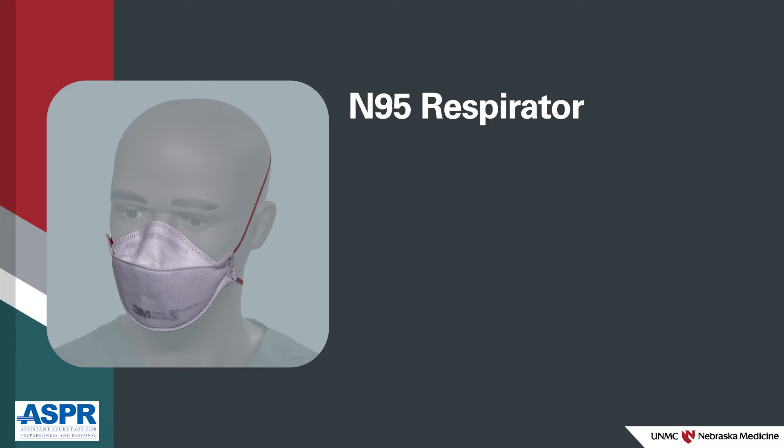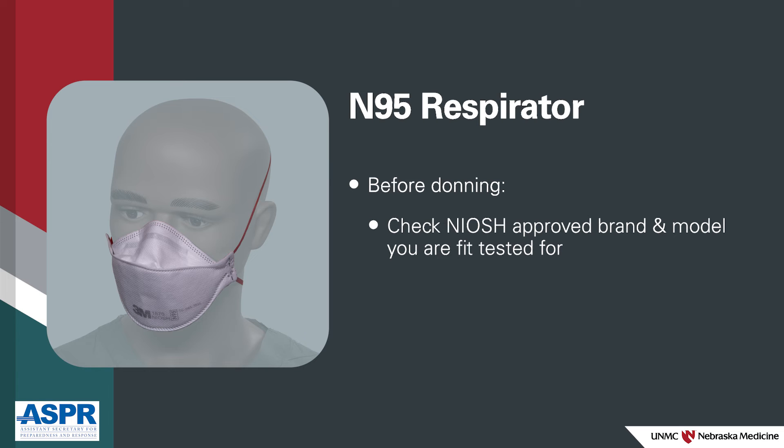The N95 respirator goes on next. Before putting on an N95, you should ensure it's the NIOSH-approved brand and model you have been fit tested for, to ensure a good seal. Follow the manufacturer's instructions for donning your respirator if you are unsure of the sequence.